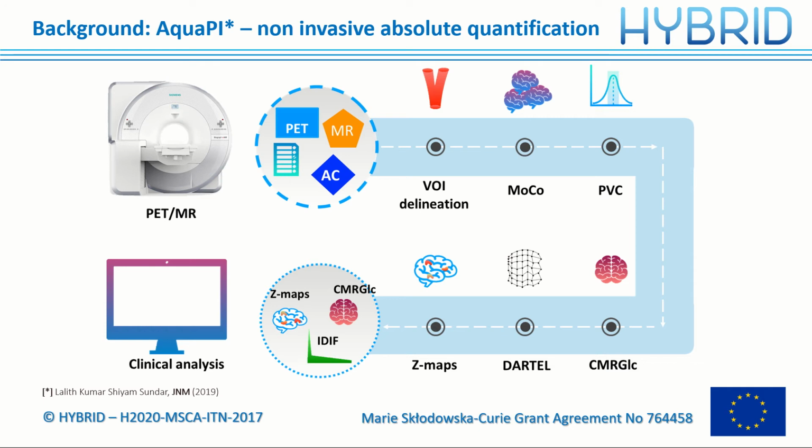In clinical medicine, we use these glucose maps and compare the glucose maps of patients with the glucose maps of a control group, a healthy population, in order to identify much more easily some abnormal foci in the brain that could possibly be an expression of epilepsy or other diseases.